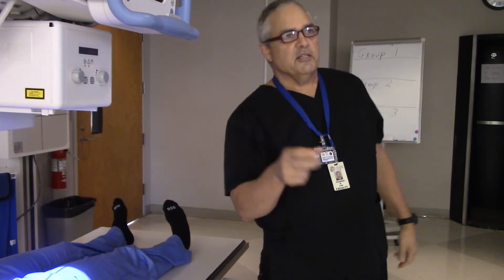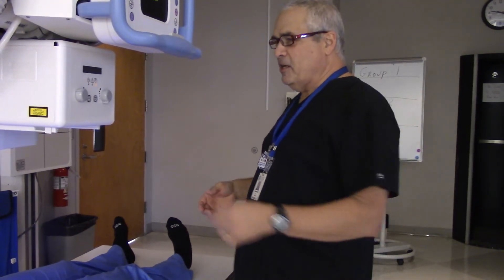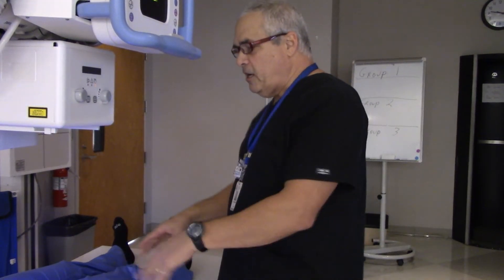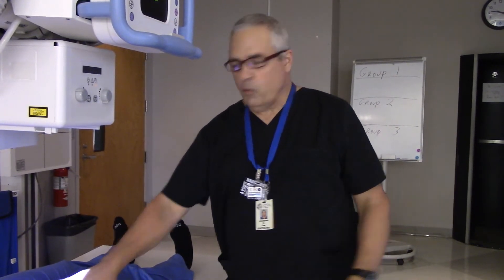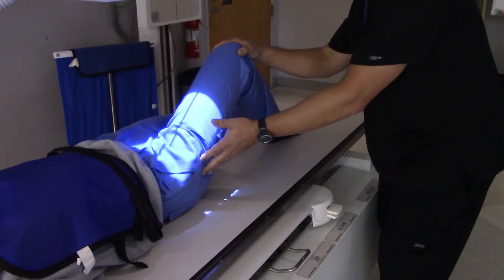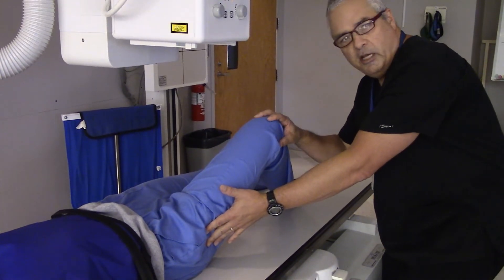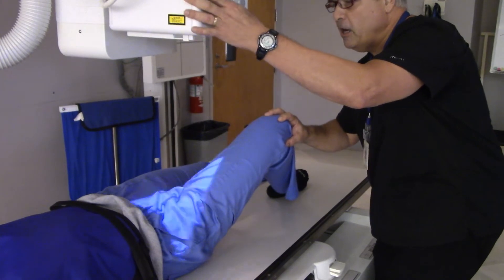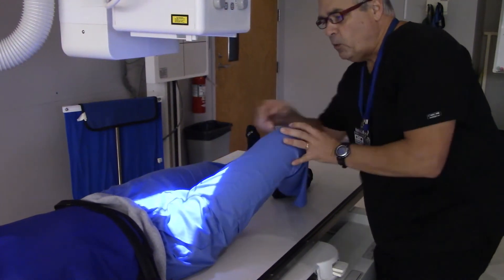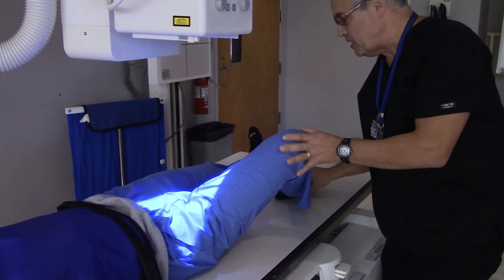For our next thing, next I need to do is a frog leg hip — this is going to be a lateral view of the femoral neck. Same kind of thing we did before with the bilateral. I'm going to bend her knee up 45 degrees and let it fall out about 45 degrees, with my light pointing down towards me. That's a good position right there. Ma'am, are you able to hold that position for me? Hold still.